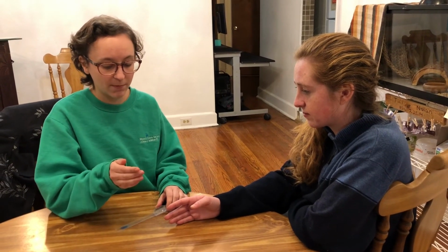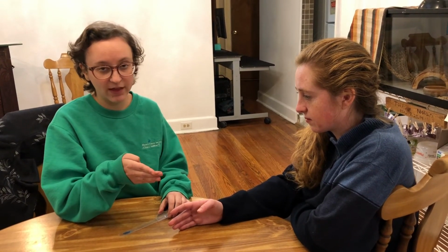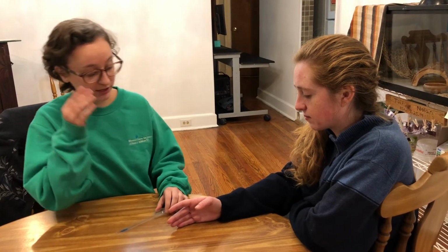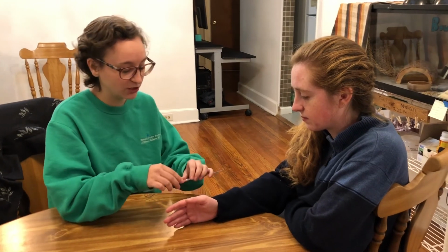Now we're gonna do goniometry measurements of the pivots of the thumb, including palmar abduction, radial abduction, flexion of the MCP joint, and flexion of the IP joint. So first we're gonna start off with flexion of the MCP joint.